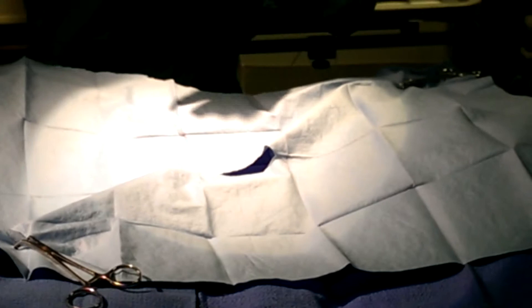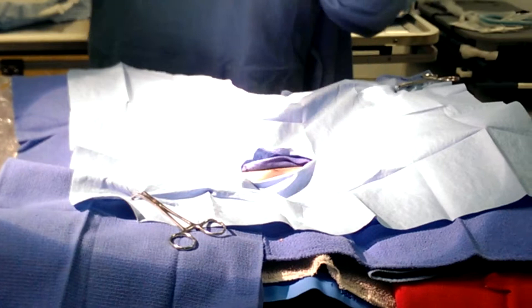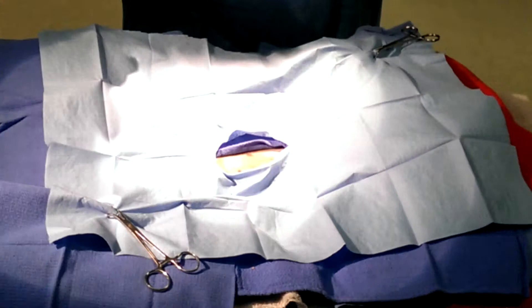Just give me a diagonal — clamp one here and one there just to help keep it in shape. A lot of times you can clamp them over top of the other towel clamps. If the drape takes too much, it's fine — I could tear it a little bit. All right, so everybody's pretty much ready? We're going to rock and roll.